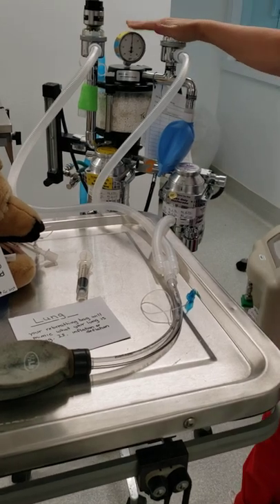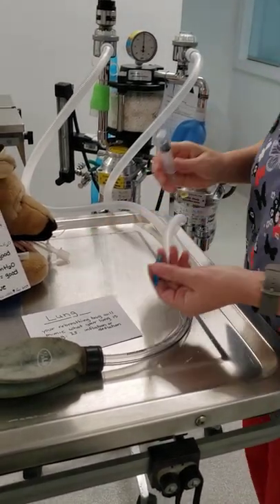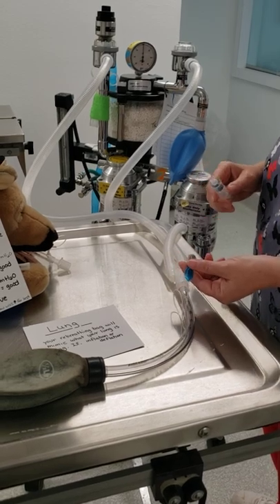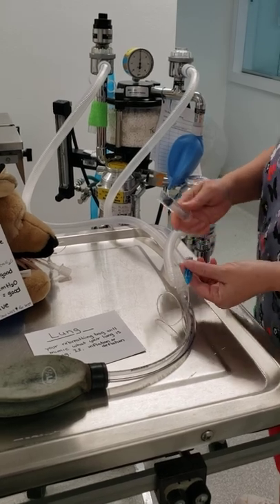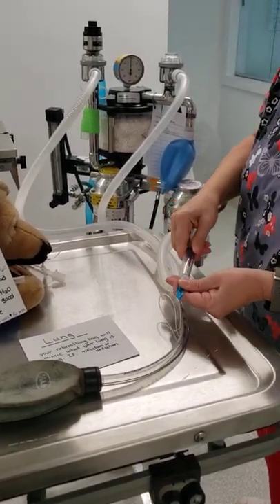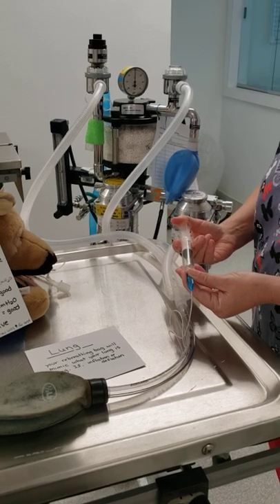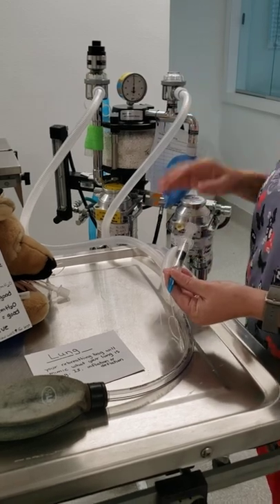You're going to be able to watch your manometer, and you need to be able to fill your cuff with air at the same time. You're also going to be listening for any airflow coming out of your patient's mouth. So what I'm going to start doing is fill my cuff. If you have a large cuff, you can start filling it about halfway before you really have to start worrying about anything. If you're not sure, start watching right away.